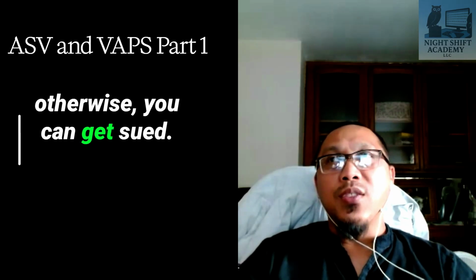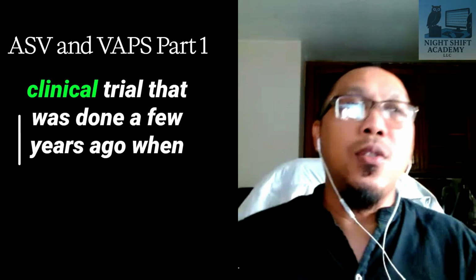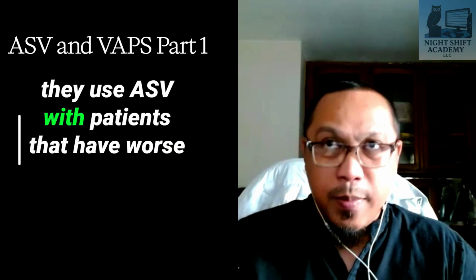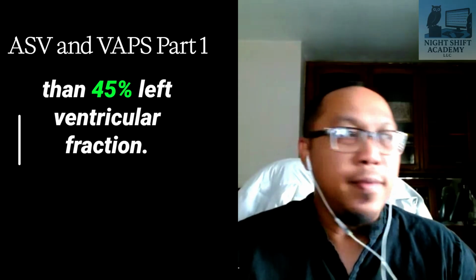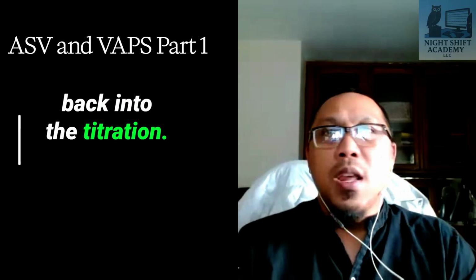Otherwise, you can get sued. There's a high mortality rate based on the clinical trial that was done a few years ago when they used ASV with patients that have worse than 45% left ventricular ejection fraction. All right. Now going back into the titration.